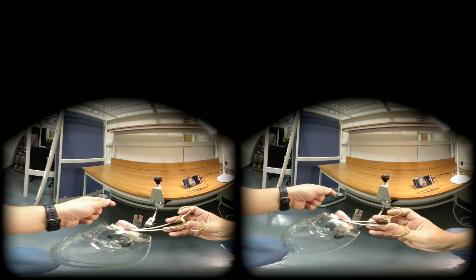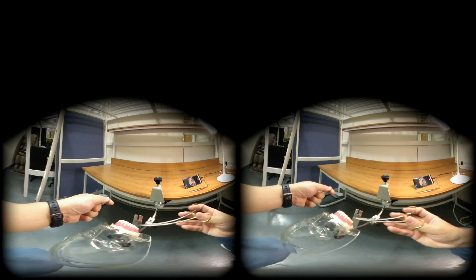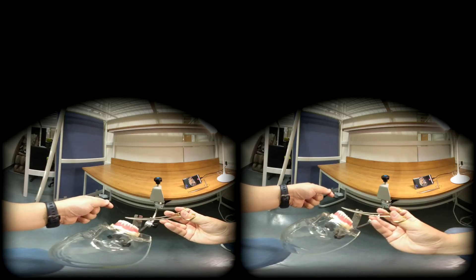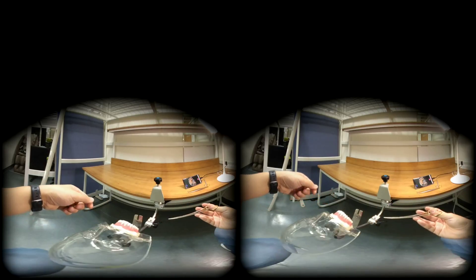Now this is the short end, and this is the long end. With the imaginary incision line, rule number one: the needle holder goes above the incision line.